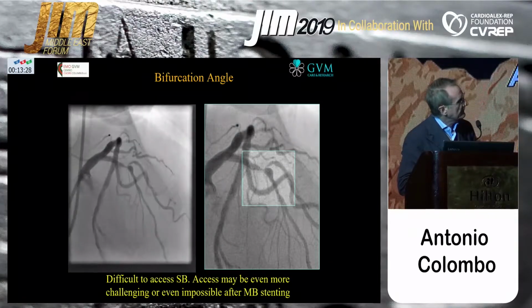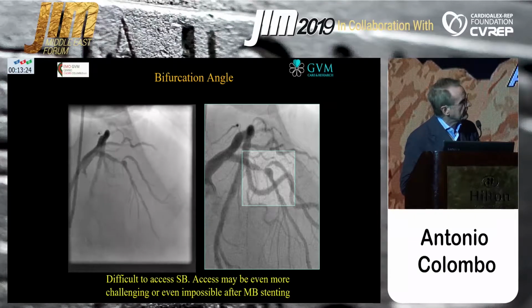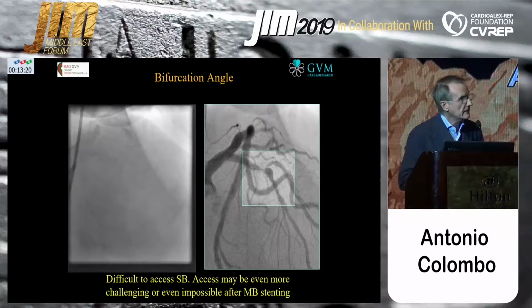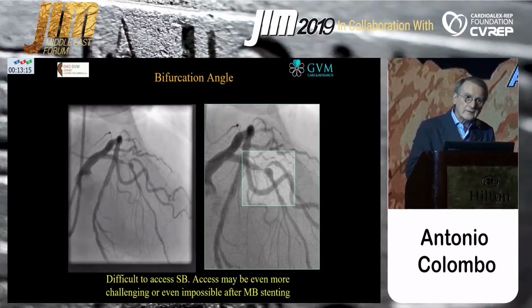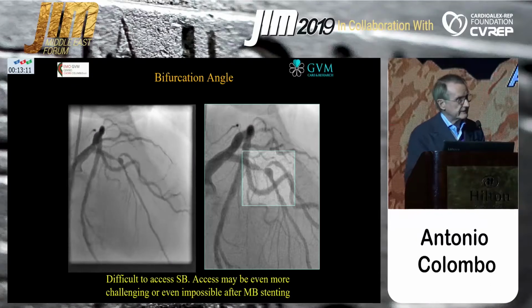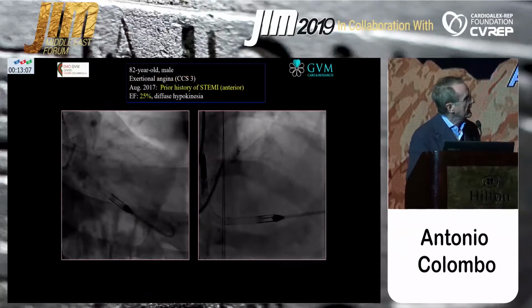This is funny. This is good for provisional, but it's so difficult to get a wire inside that maybe you go with 2 stents just based on the technical difficulties. So, as you see, sometimes decisions have to be made.